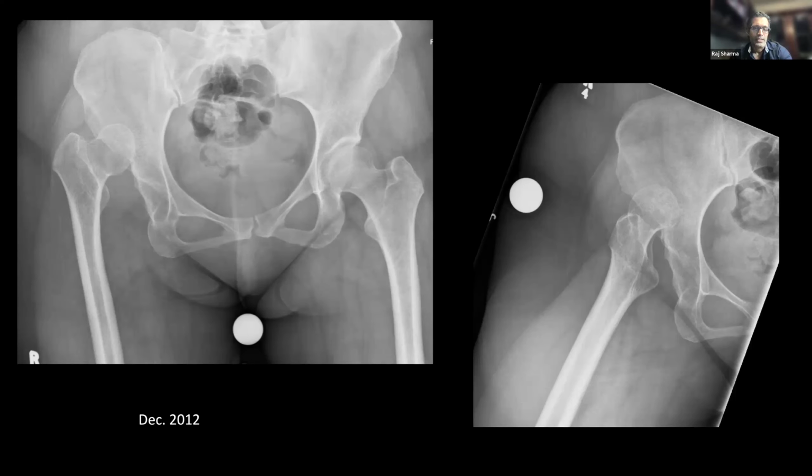On the femoral side, again, the big leg length discrepancy. So I'm thinking, first of all, subtrochanteric osteotomy. I choose a stem that I can easily achieve that, for example, the S-ROM type stem that could ream distally. I can make a subtroch osteotomy, shorten it down, and then use that. I do use that piece of bone as graft around the osteotomy site.